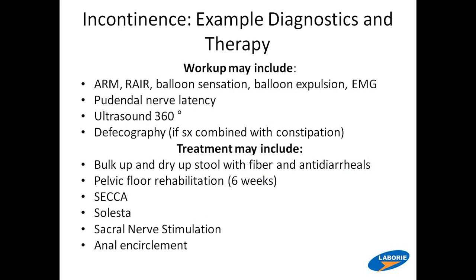No, I mean, I think it's personal preference. I think most everybody's going to the high resolution because it's just visually, you don't have to do what I was showing you guys to look at. In a way it's for those who are not as initiated. For me, I really do have to study the curves, and I sort of make it in my mind. But for high resolution manometry, it's right there, the full picture, the 3D image, and all of the pressures at once. So it's just the way most people are going. It's new and improved.